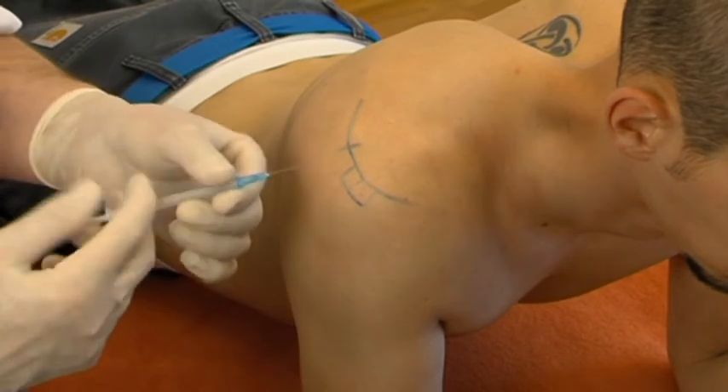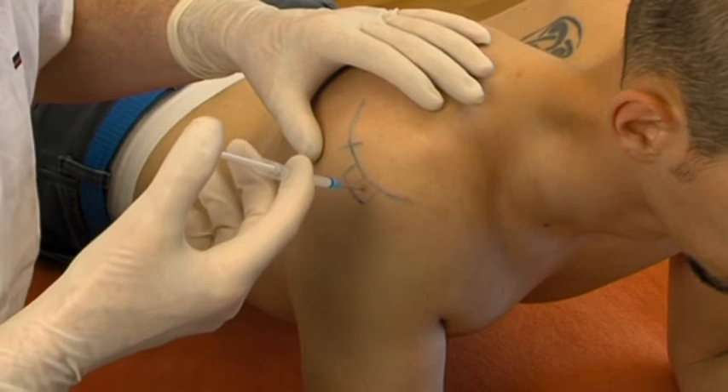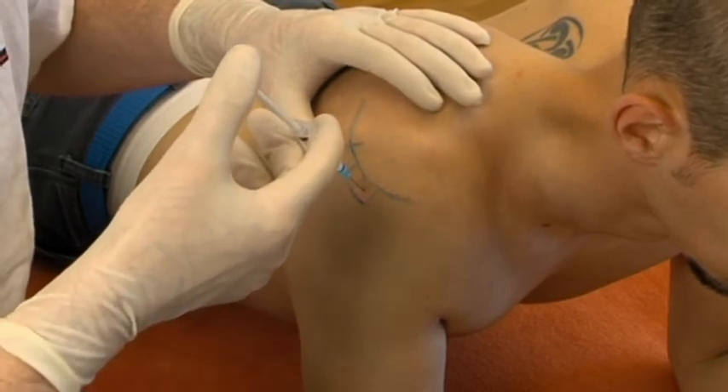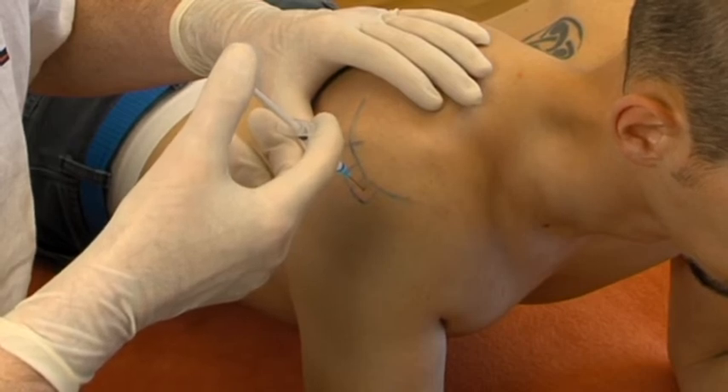The needle is inserted in the middle of the spot, vertically downwards, aiming at the tenoperiostal insertion, which is reached after passing through soft tissue for about 2 cm. Just before touching the bone, the tougher resistance is felt.